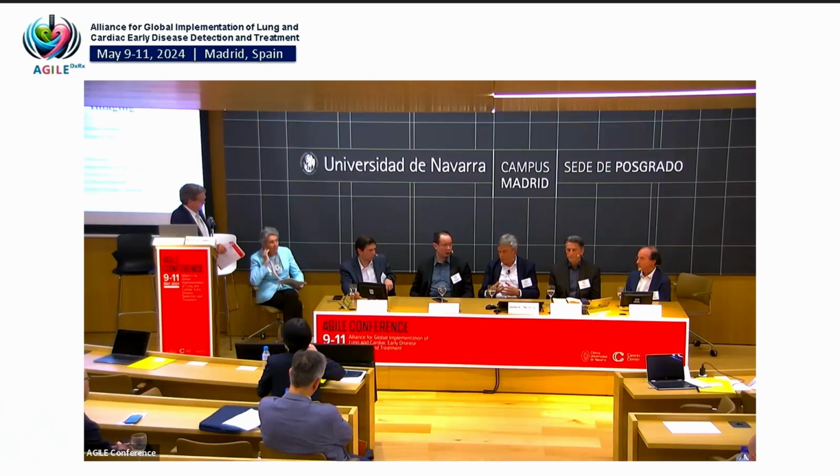In our studies comparing the readers, you find that at -1,000 the reader agreement is the best, because you get rid of all the noise. Then they agree the most on the images. So it's all explainable, but you lose everything that has to do with emphysema when you go down to -1,000.